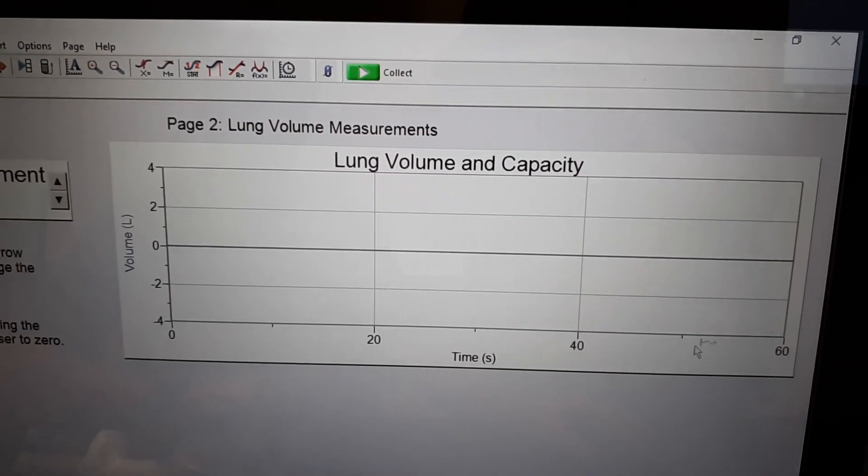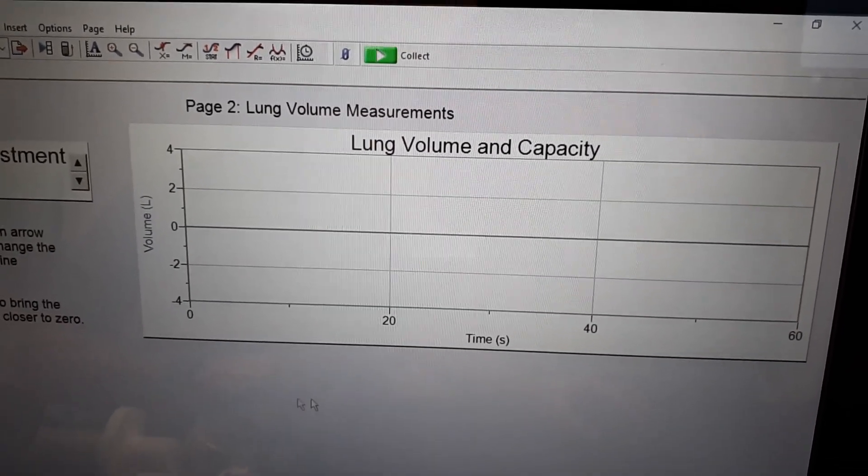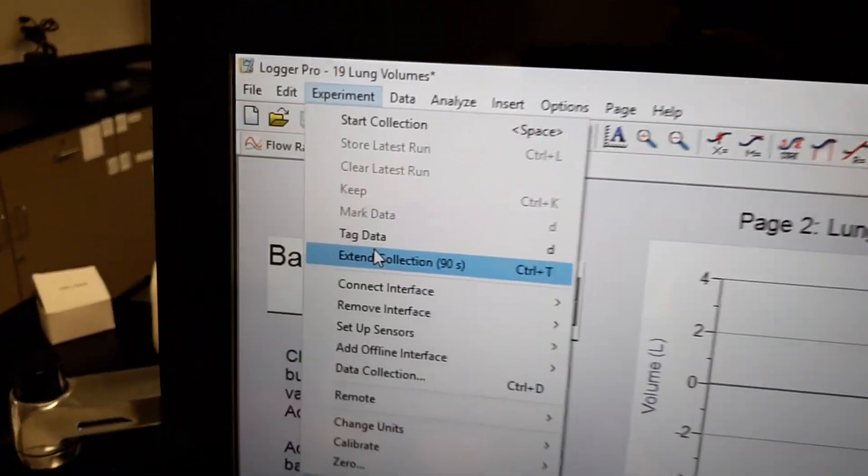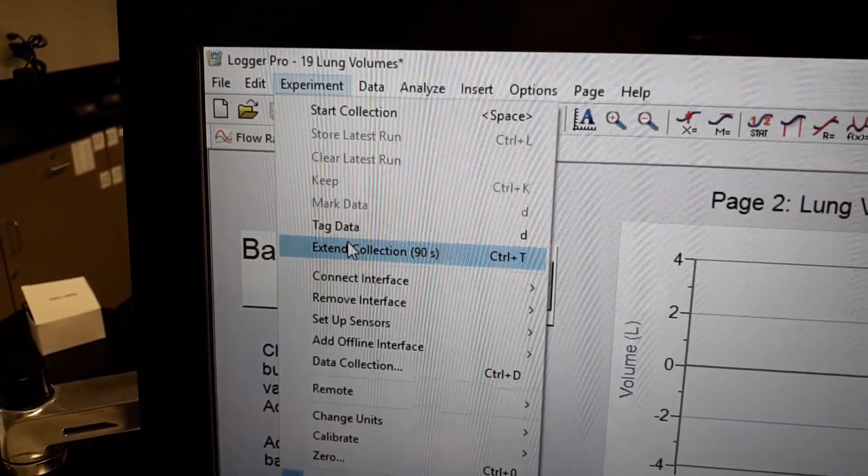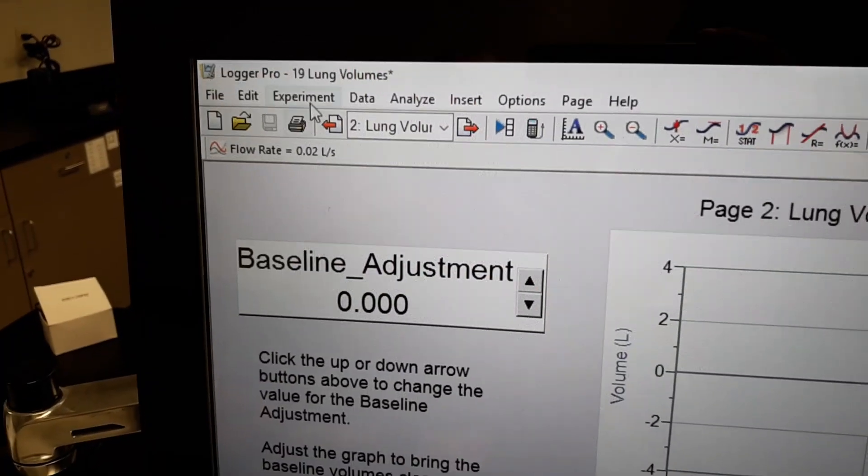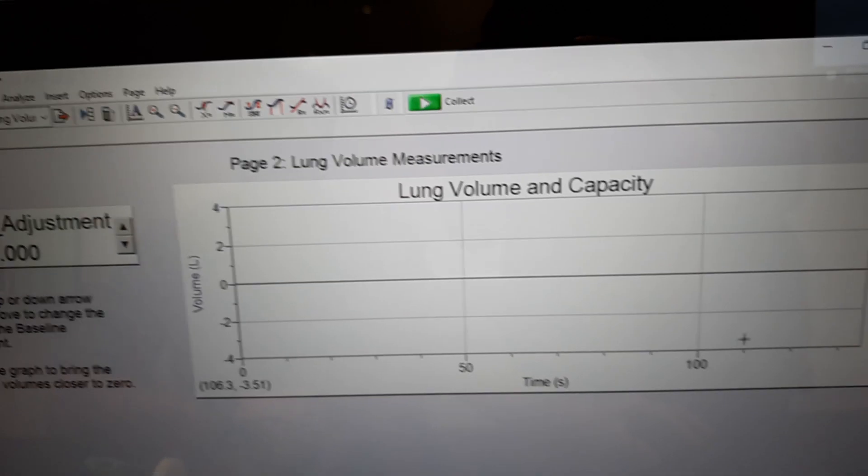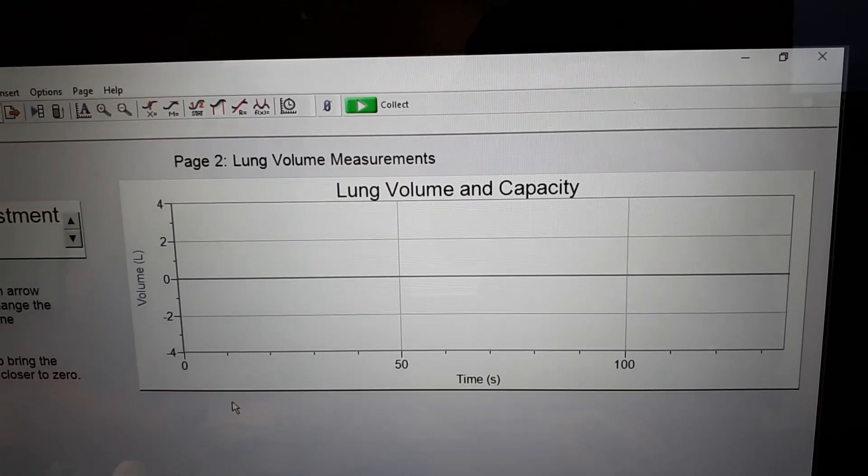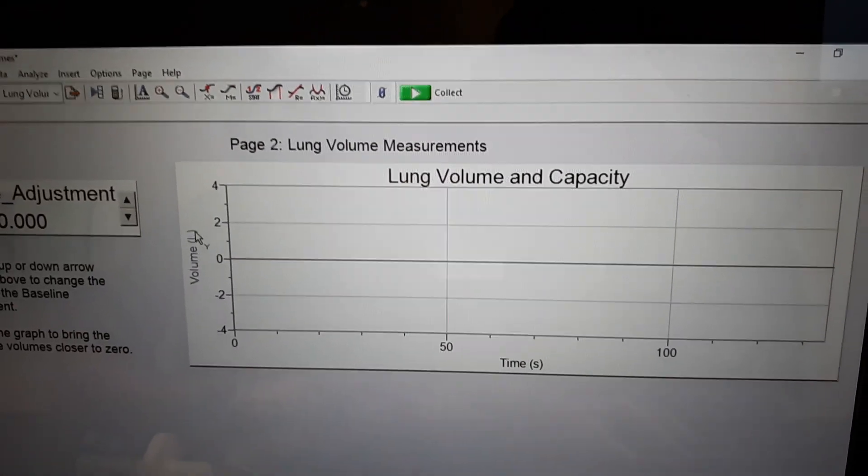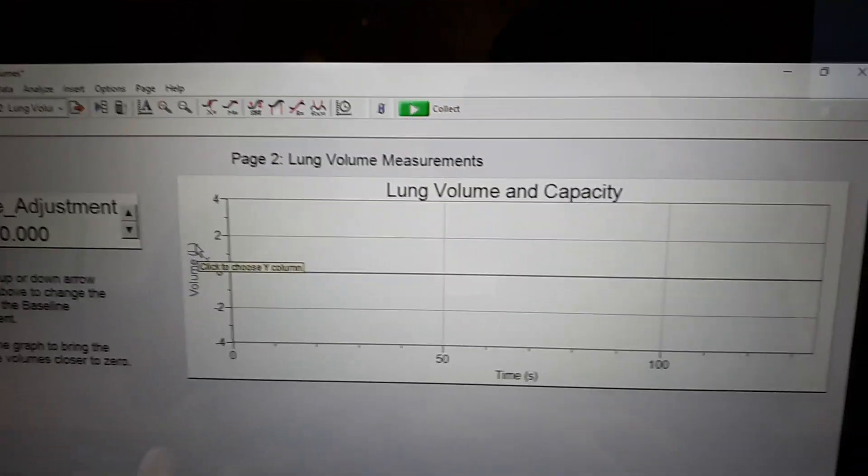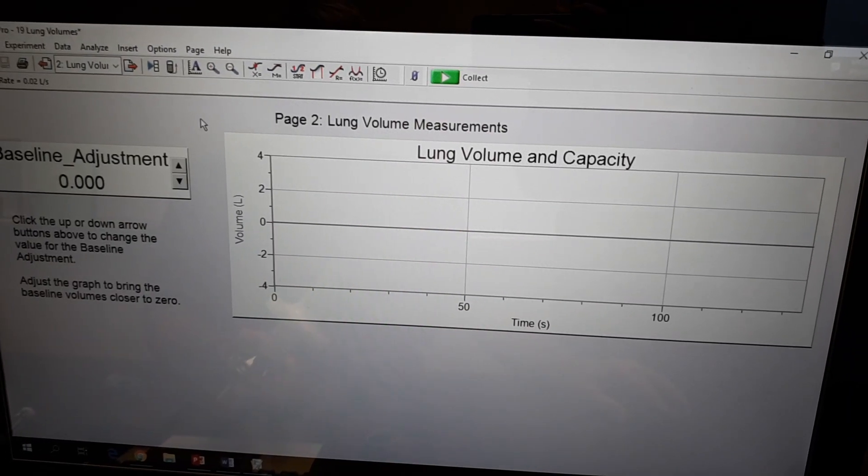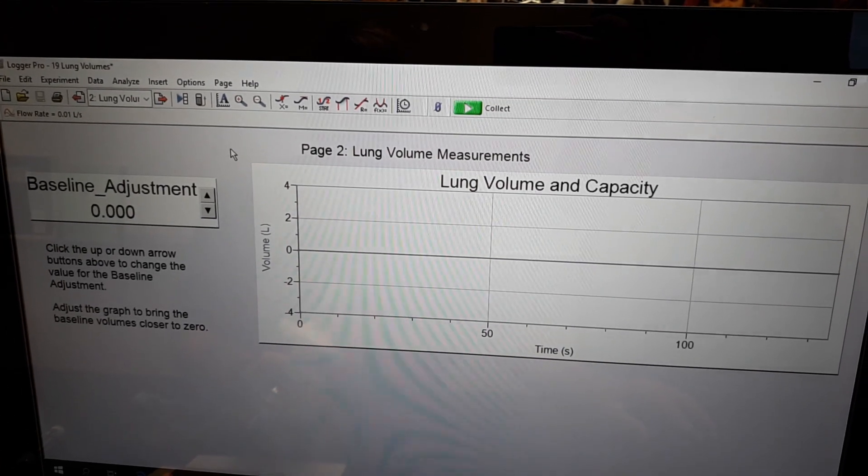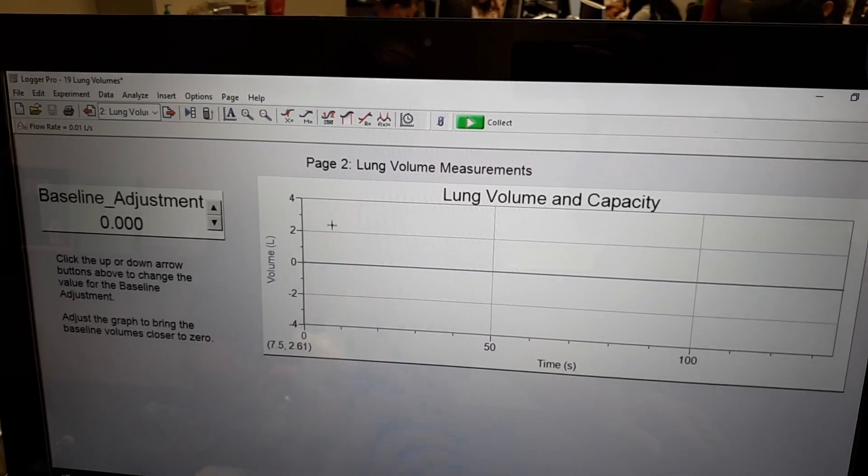We need to change this time a little bigger. It's just 60 seconds, zero to 60. So we're going to go up to Experiment, extend collection. So that'll go to 90 seconds. And then we're going to do this again to 135. So now we've got a time frame of 135 seconds. Volume is the same. We are all set as far as the computer goes, and this will collect all our data.